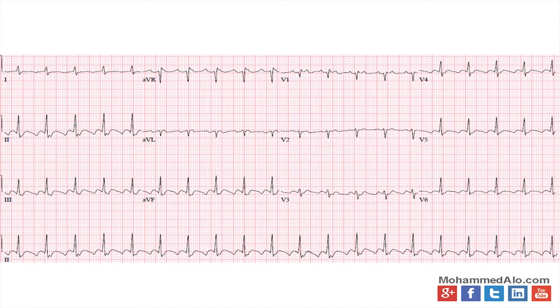The next one here, if you look at it just globally from far away, you see this sawtooth kind of pattern. You look at lead 2 and 3, and you can also see it in the rhythm strip down at the bottom. You see it in V4. This is your basic atrial flutter pattern, and there's nothing really more exciting going on. These can easily be ablated now.